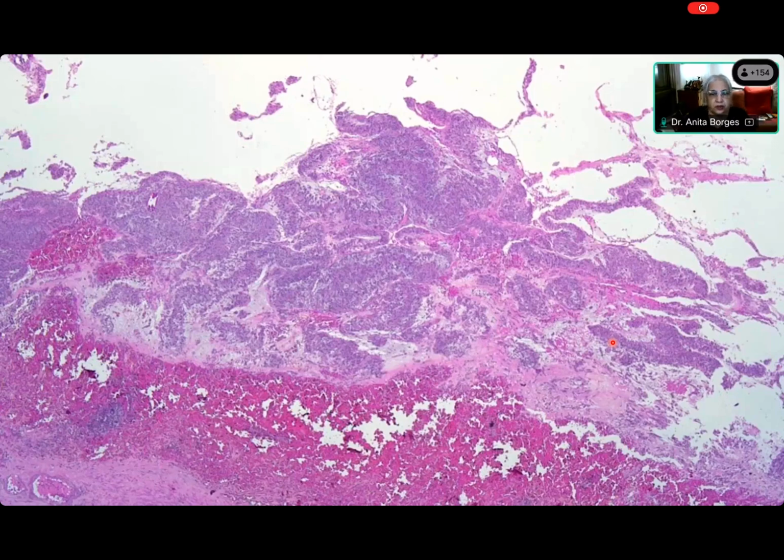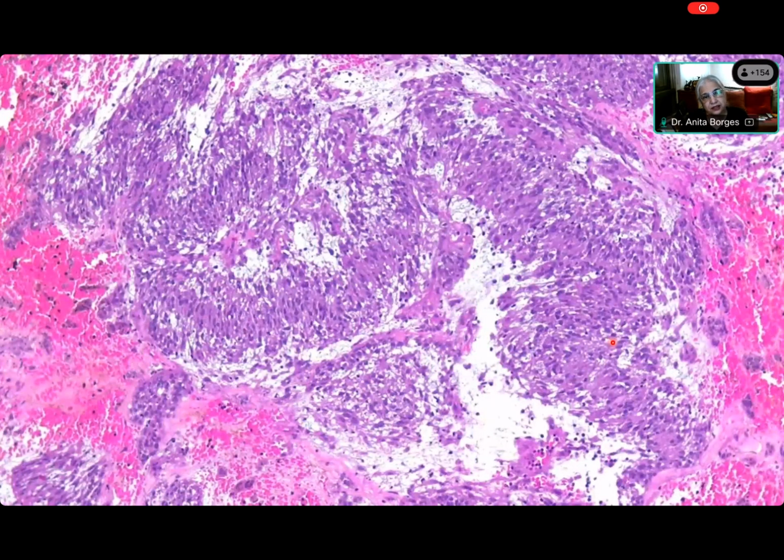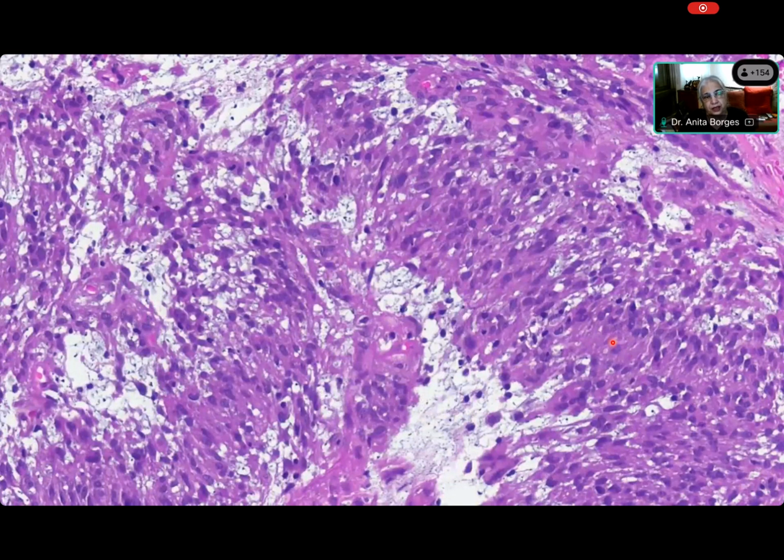All right. Come on. What are you seeing here now? This is the solid area, right? Yes, ma'am. Palisading. Very good. Palisading of tumor cells. So it is a spindle cell tumor. It's a solid spindle cell tumor with palisading of the nuclei. Obviously, they're tumor cells, but you can see very nice palisading of the nuclei. It's beautiful. Okay. So why do you think there is cyst formation happening?